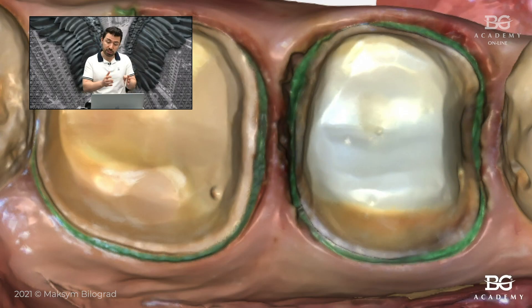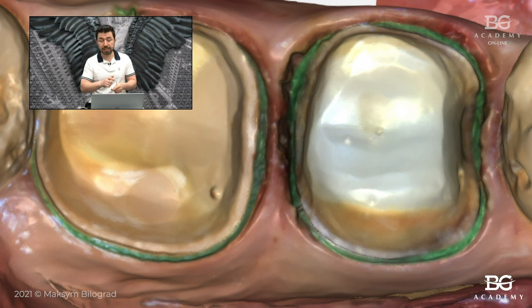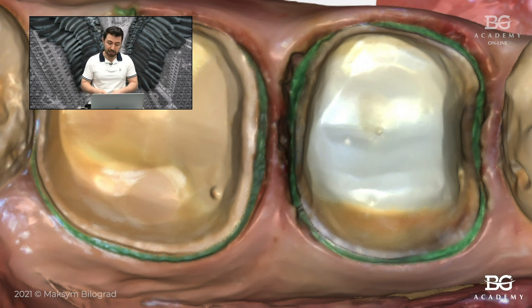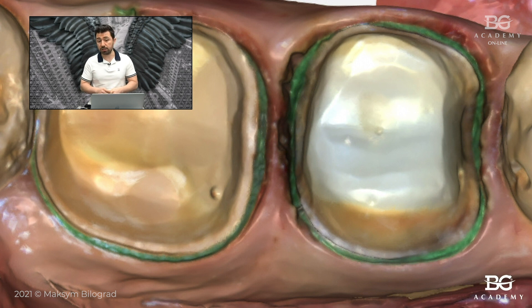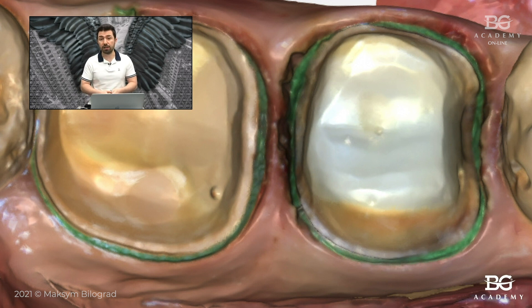I had a few minutes to scan. The sequence was: once I rinsed out the retraction paste, I took the intraoral scanner and scanned, and then I took the impression. I would like to ask you all to share in the comments your tips, tricks, or secrets for retraction in similar clinical situations, because I want our audience to benefit not just from my content but also from practical advice from you.